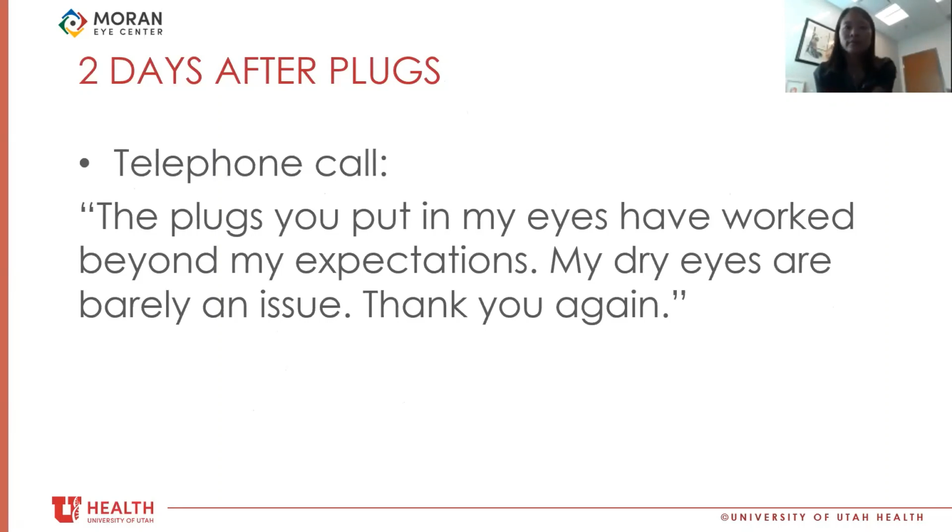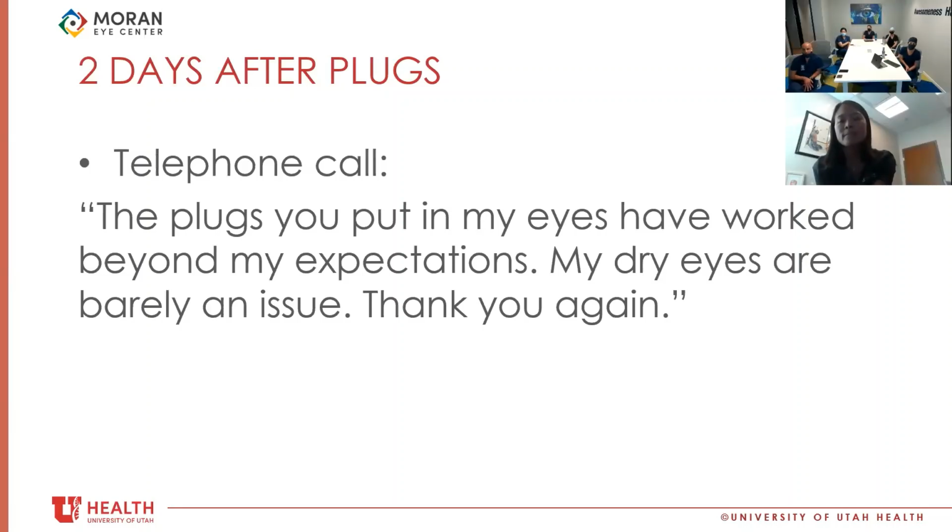Do you think that the correction of the hyperopia could have been because you did the myopic treatment first, and the stroma is kind of there exposed, and then you did the hyperopic treatment afterwards, so perhaps there's more of an effect that was created on the cornea, given that it's been maybe drying out? Yeah. Possibly, but I wouldn't have expected it to be that effective, because I got him from like a +2 to +0.5. Interesting. Well, it's interesting you haven't heard back from him, so I'm guessing he's doing okay.